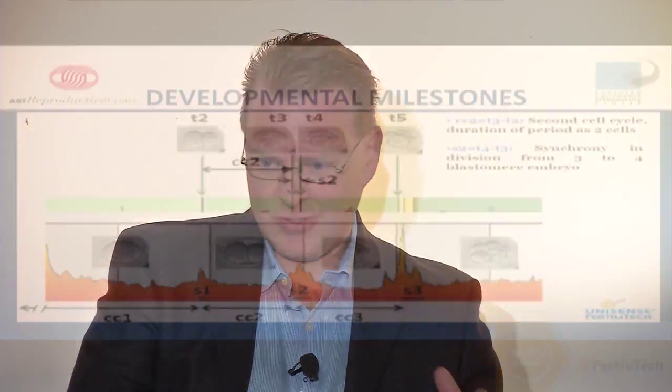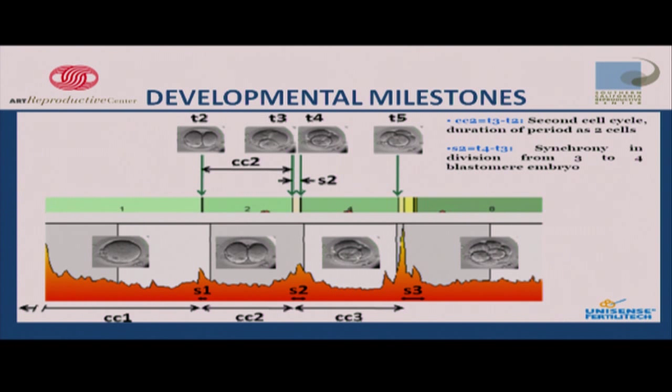And if we use the technology of looking at like 3,000 different images across every embryo, we can find these minute, small changes that really decrease the chances of having a pregnancy. So we also use time points in development. In the oxygen discussion, previous group, and in this group, you find that there are time points of when embryos need to sit and rest, when they need to replicate, if they take too long or too short a period of time, and watching for those bad signs that I just showed you.